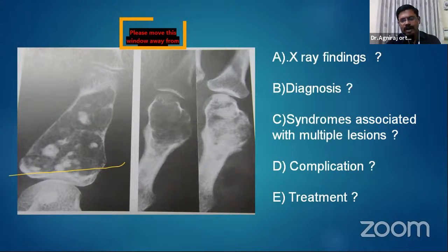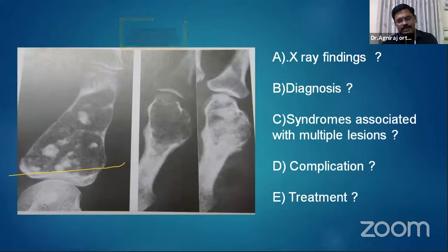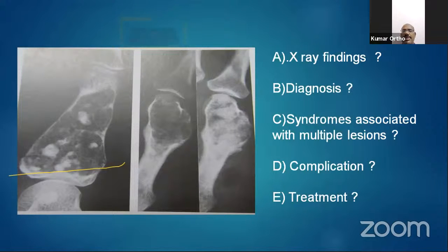Vishal Ravi, you follow the order. You write all the 7 points side by side, page by page. If you follow the order, it will be very easy. No need to confuse; don't go here and there. We don't want just the diagnosis. You should know how to read the X-ray. That is the main point. If you follow the 7 points, you will be very familiar with them. Every time you go, you will read the 7 points.